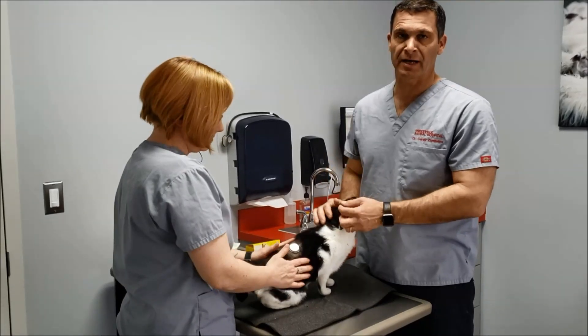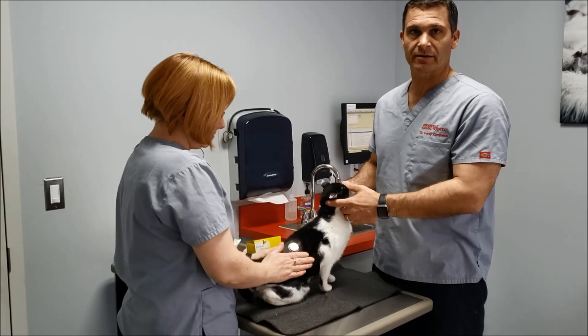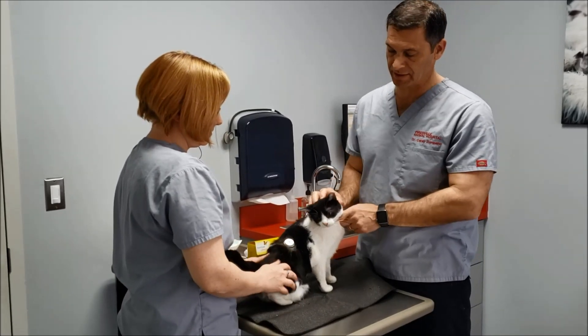Hi there, we're giving you just an update on the Freestyle Libre. Some people asked about what it's like to do it for a cat, so we've got a happy volunteer right here — Stella.